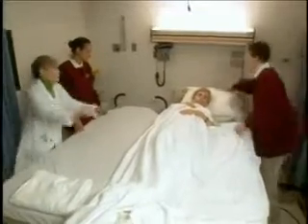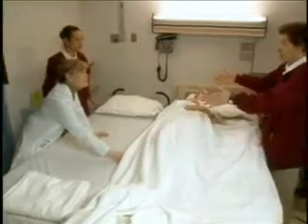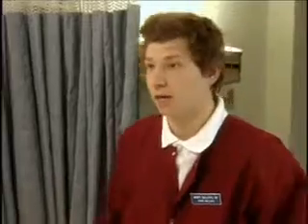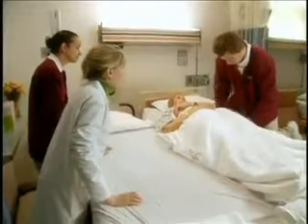Okay, now we can take the pillow from the bed and put this on the stretcher. Thank you. Where do you want us in this? Well, if you two can just stay on the stretcher side of the bed, and I'll work from this side. Okay. Okay, now just kneel up on the bed. Keep your knee at the upper torso closer to the patient than your other knee. Okay, now I'm just going to roll the draw sheet as close to the patient as possible before grasping it securely and transferring the patient.